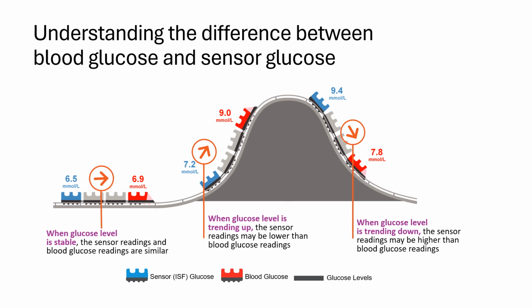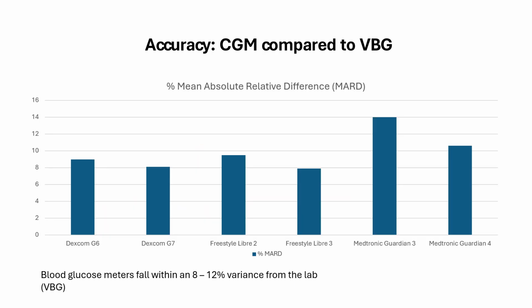The more important one is if the glucose levels are falling, and let's say your sensor glucose reads 4.4, you know that blood glucose is already lower than 4. And so that's when you can actually treat a low glucose before you ever got to 4 by setting the alerts at possibly, when the sensor glucose drops to 4.8, tell me, because I know that it's very close to 4 in my blood glucose.